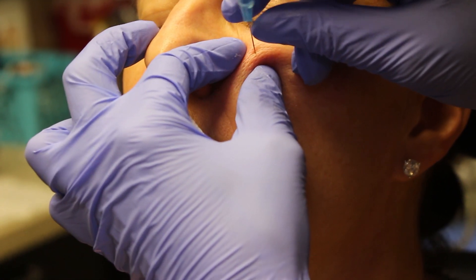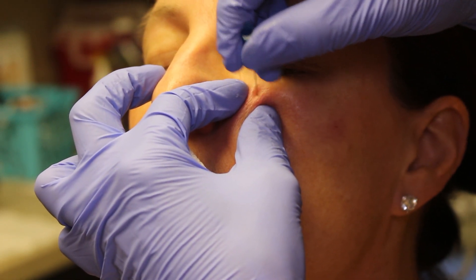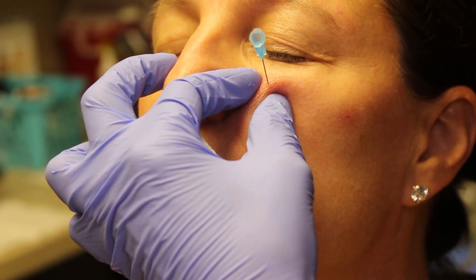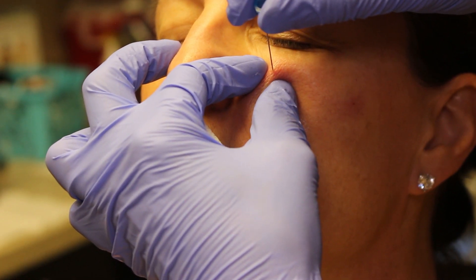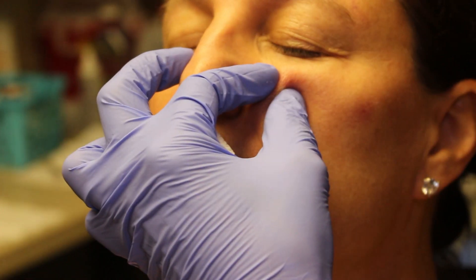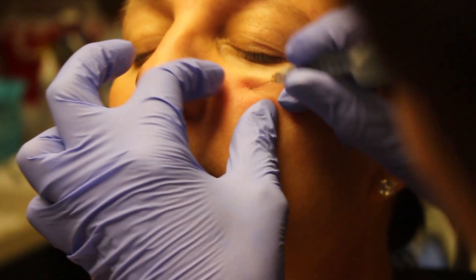One, two, three, four. So this just makes just a tiny little hole — this is where the cannula is going to go.